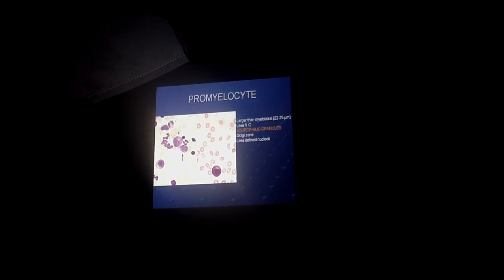Eosinophils yan. Another promyelocyte with violet colored granules. What is the function of the neutrophils? Bacterial infection, anong ginagawa nila pag mayroong bacteria? Phagocytosis, very good. Kinakain nila ang microorganisms, particularly bacteria.